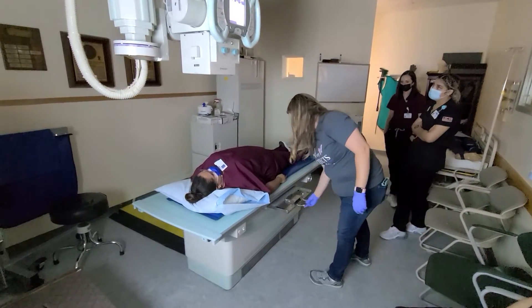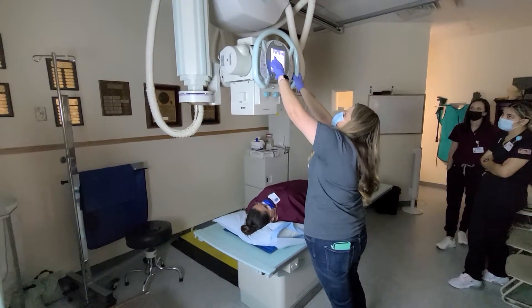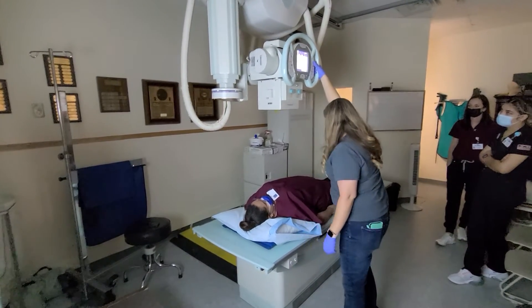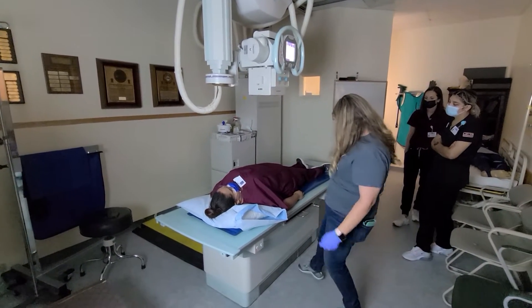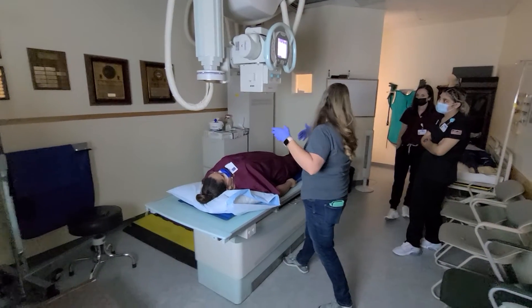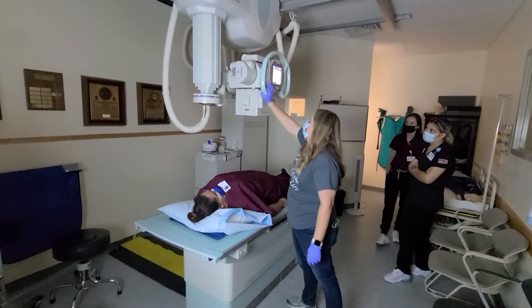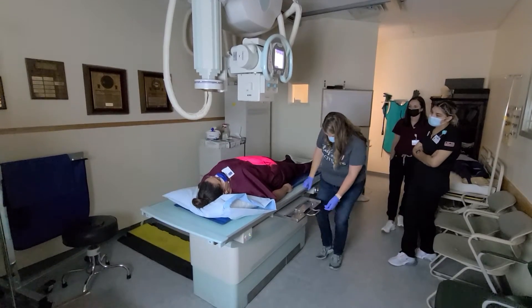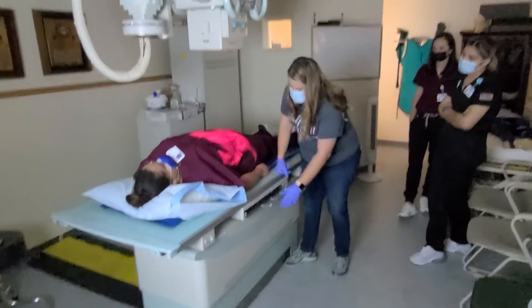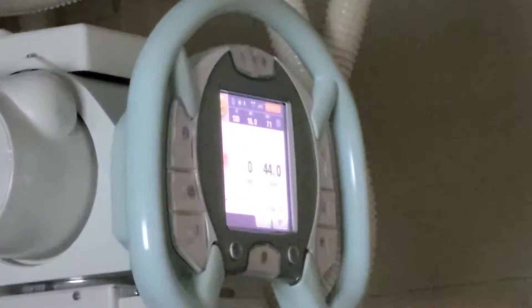We have our 14 by 17 inch IR lengthwise. I'm going to detent the tube and change to table bucky, since we're going from tabletop to table bucky. I'm going to raise the table to help me out. We're going to use that whole 17-inch length of the IR, so we want it at 44. Then the last thing I need to do is line up my IR. You can do these steps in whichever order you want — just get your distance, get detented, and line up to your bucky.